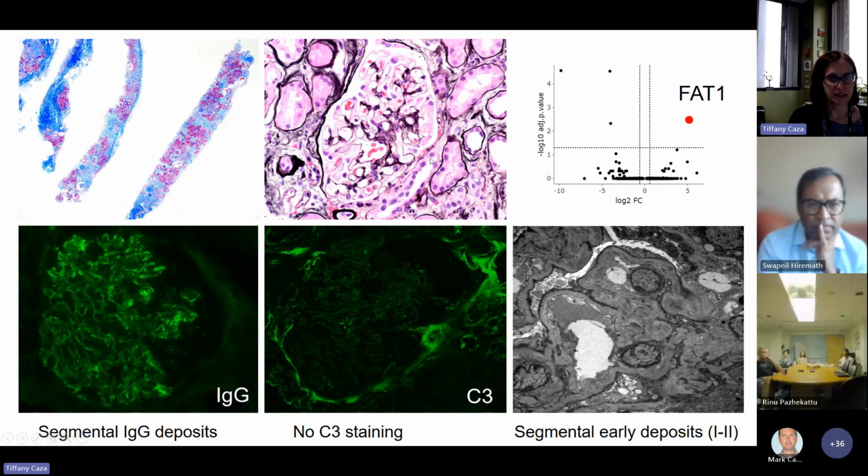There tends to be no glomerular proliferation, and C3 will have decreased staining similar to protocadherin 7. You typically catch early immune deposits for this particular antigen, and here's a volcano plot for FAT1 for one of our cases. We don't have that antigen brought up at Arkana yet.